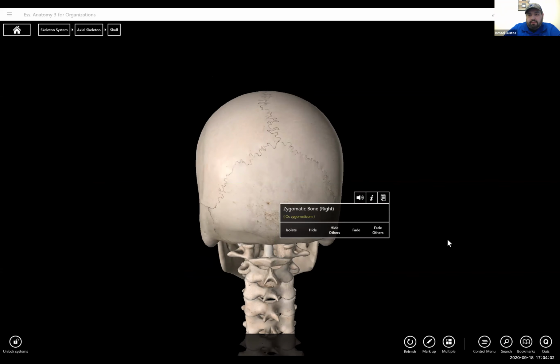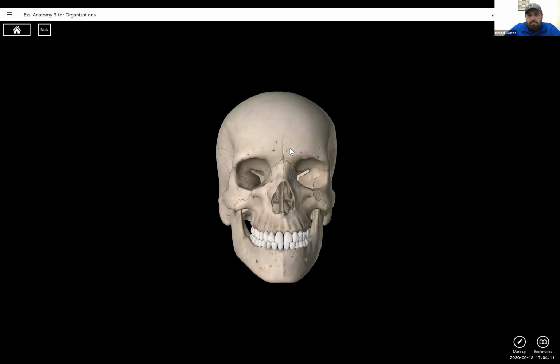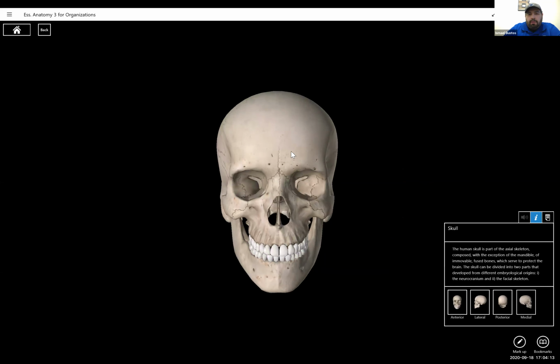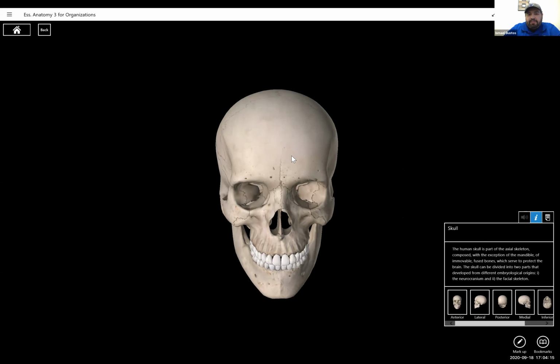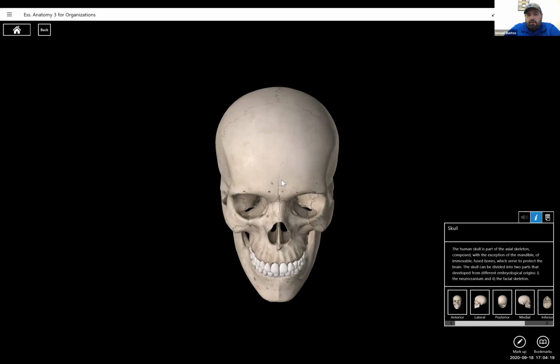Actually, you know what? Let me go back to this. So what I want you to see is, let's isolate the skull there. If you're the image receptor, you want this patient's neck flexed, so that you want the nose and forehead on the image receptor, and that'll bring the OML perpendicular. That's how you want this projection to be done, because you want this frontal bone to be flush on the image receptor.